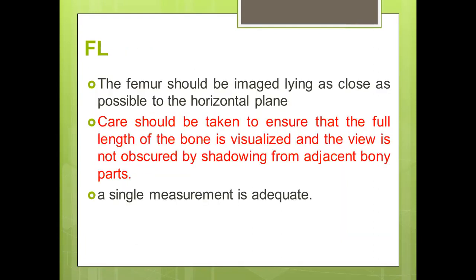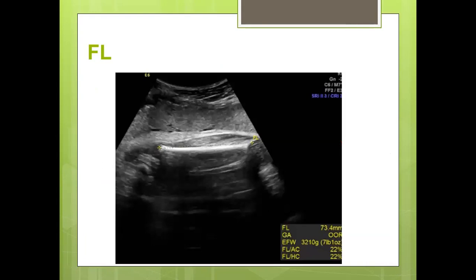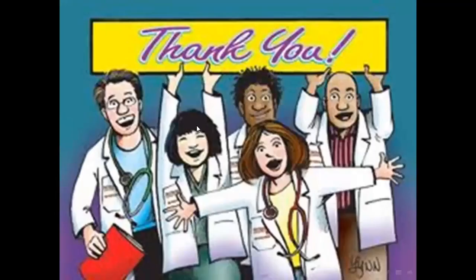The last measurement is femur length. Femur length should be measured with the femur lying as close as possible to the horizontal plane. Care should be taken to ensure the full length of the bone is visualized. A single measurement is adequate. We prefer the femur to be in a horizontal plane, not angled, and measure the longest distance between the ends of the bone to get a good result.